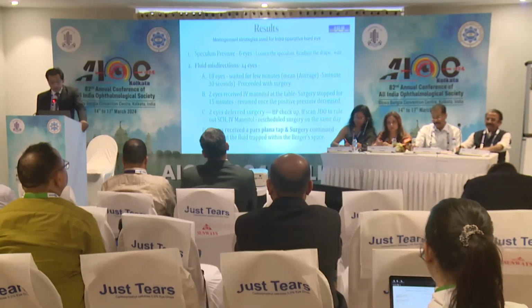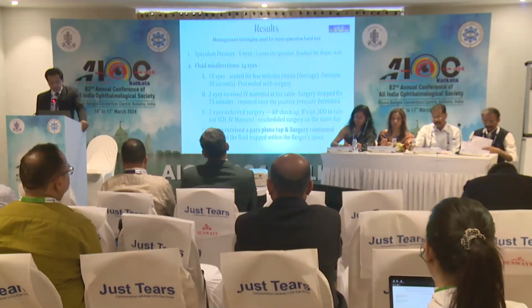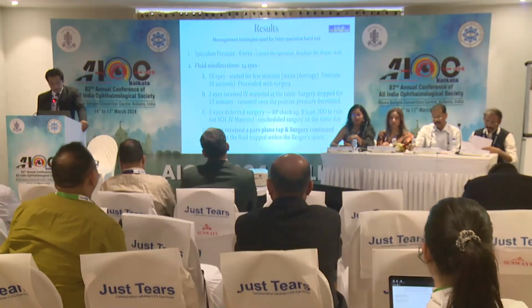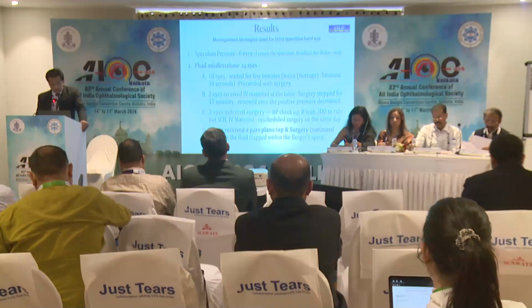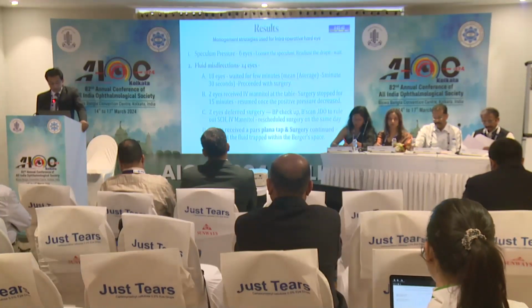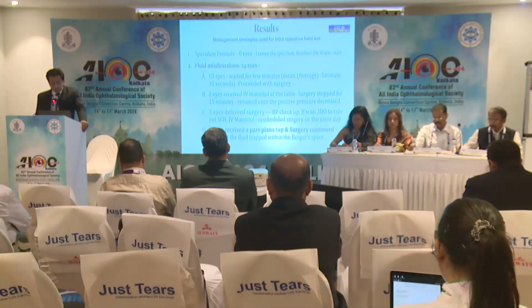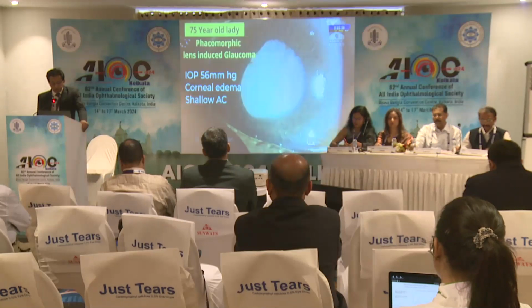In 18 eyes of fluid misdirection, we just had to wait a few minutes for it to settle down. 2 received IV mannitol on the table. In 2 eyes we had to defer the surgery for a few hours, evaluate, and then get back. 2 eyes received pars plana tap, and the surgery could be continued in the same setting. Let me take you through a few cases of different ways of management.